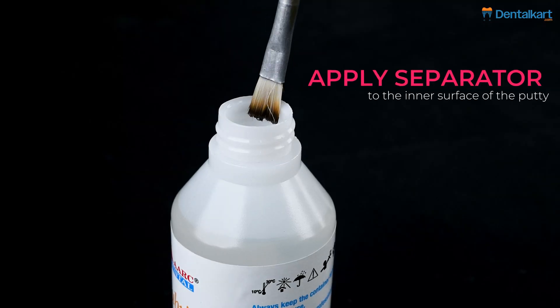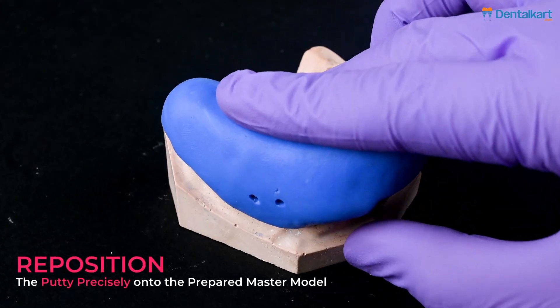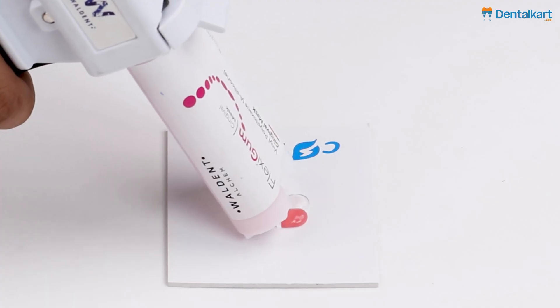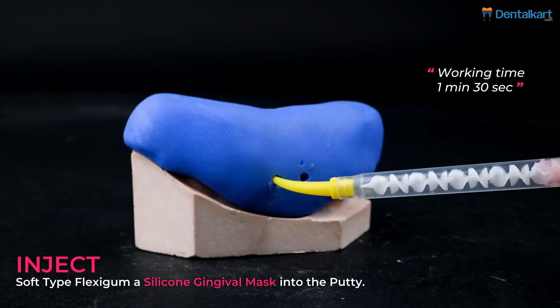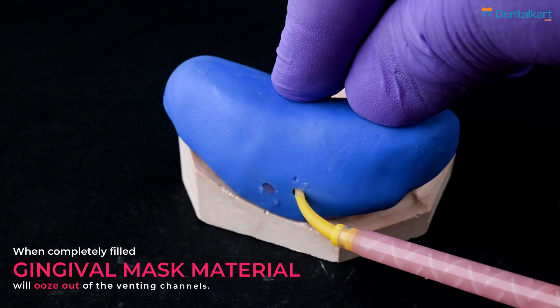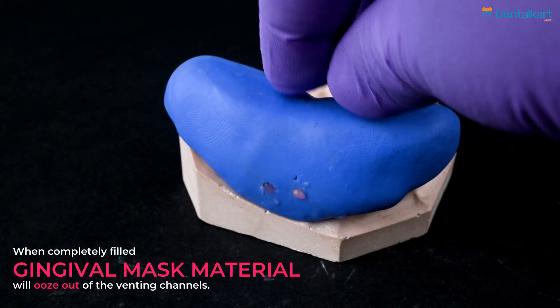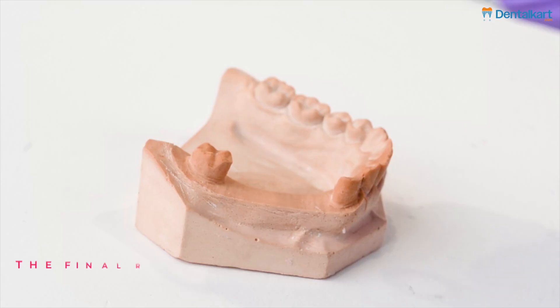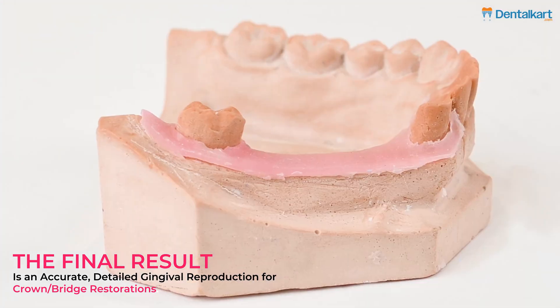Apply a separator to the inner surface of the putty. Reposition the putty precisely onto the prepared master model. Inject the soft-type Flexigum silicone gingival mask into the putty. When filled, the gingival mask material will ooze out of the venting channels. Remove the set gingival mask from the master model. The final result is an accurate, detailed gingival reproduction for crown bridge restorations.